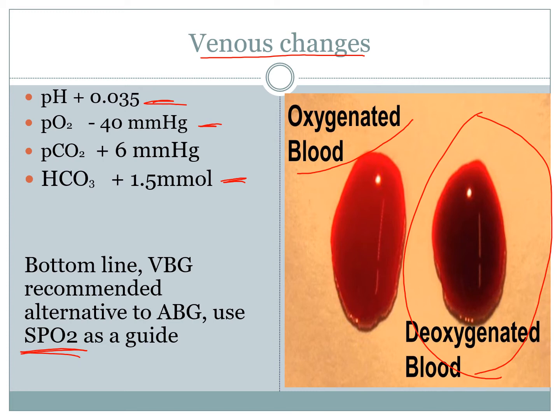Most of the time, you guys definitely will be using venous blood gases, putting it in your ISTAT in order to read these numbers. So just keep in your mind that what you have learnt as normal has a slight difference. The main ones to look out for is your mid to high normal range of PCO2, just look at it carefully, and obviously your PO2 number. Alright, so that's step 1 through to 4. So that's our normal ranges.